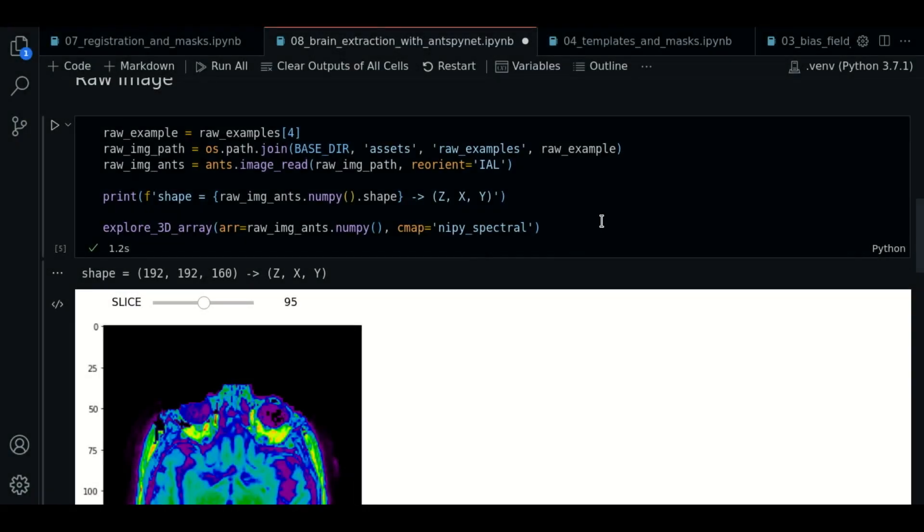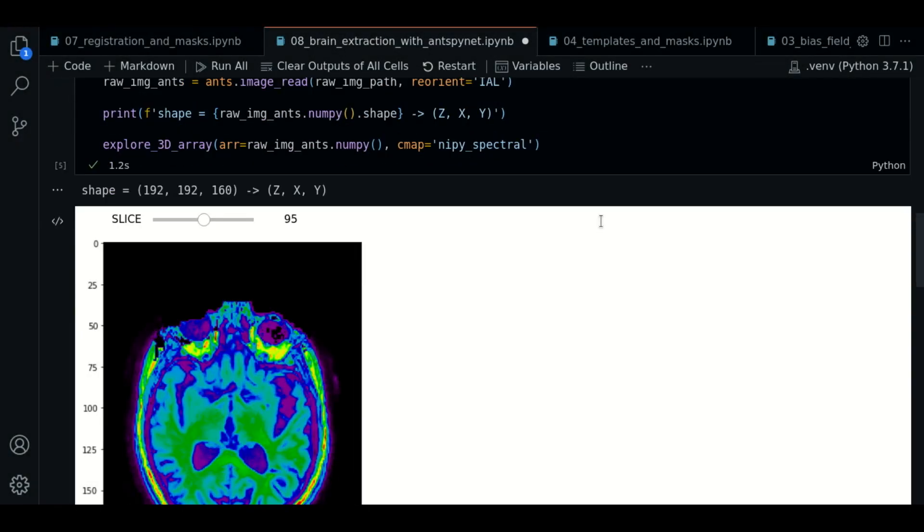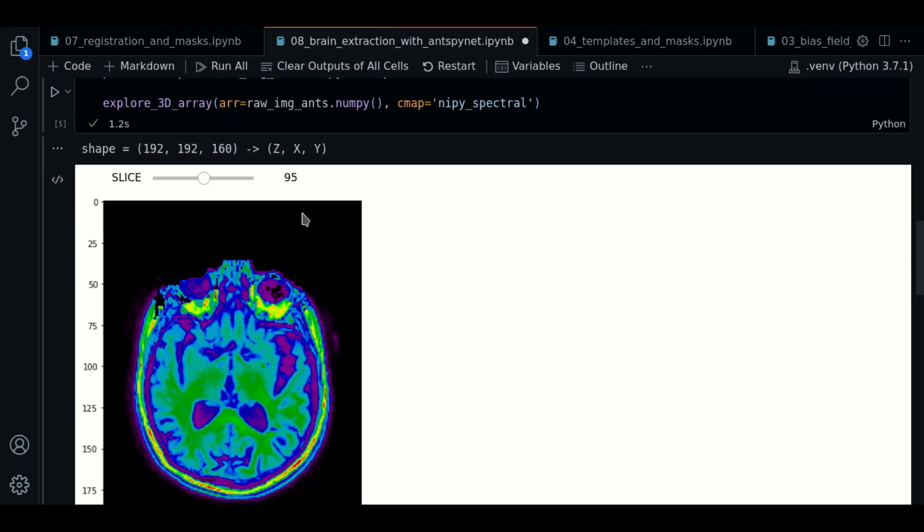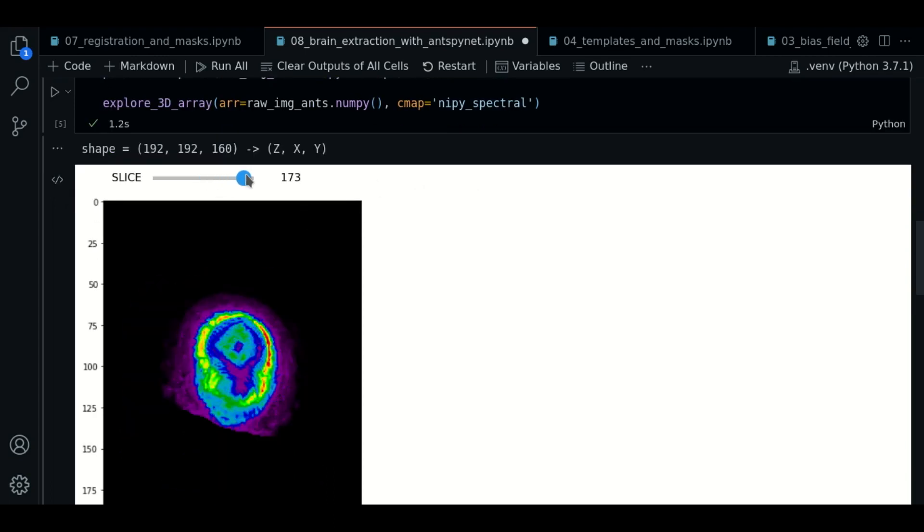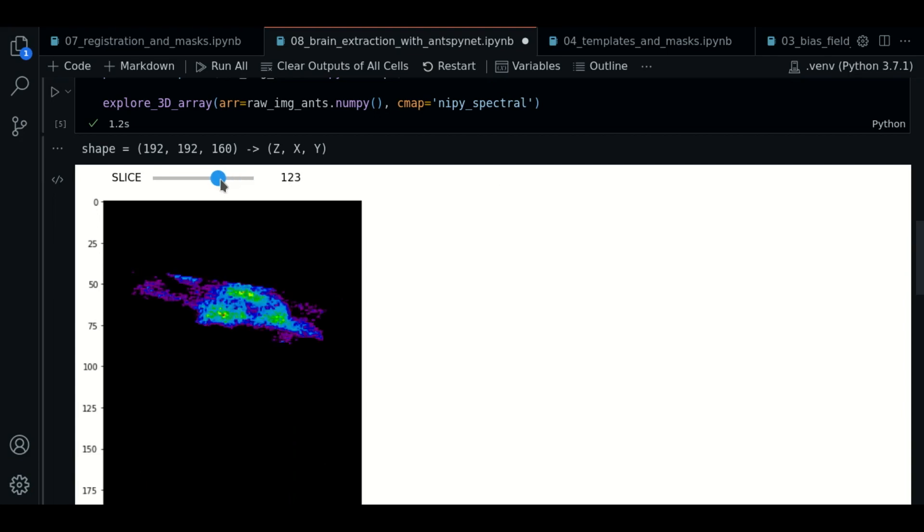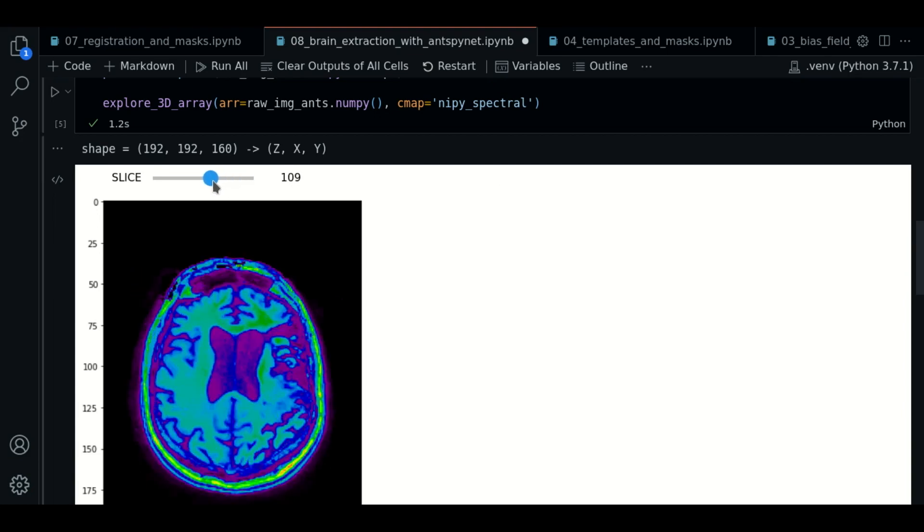First, we have our raw image already loaded. This is the image that we will use to extract the brain. We'll explore a few slices just to see how it looks like.